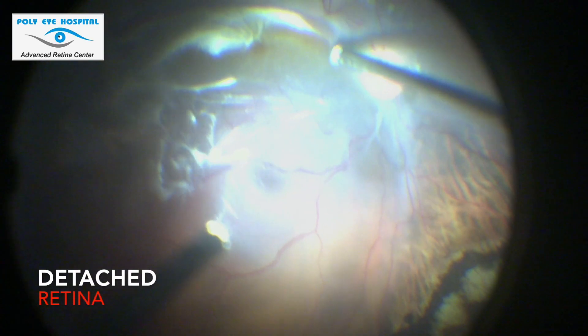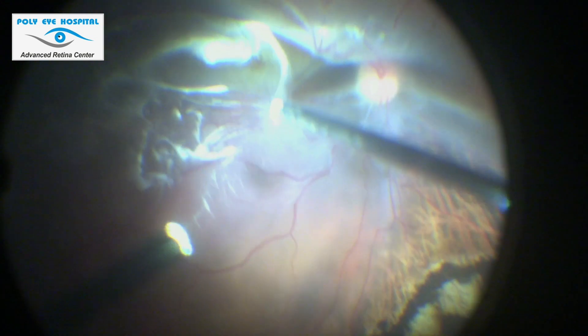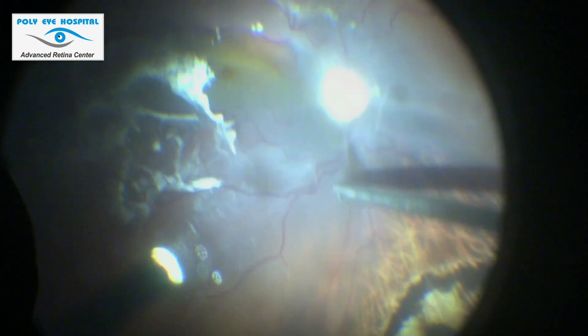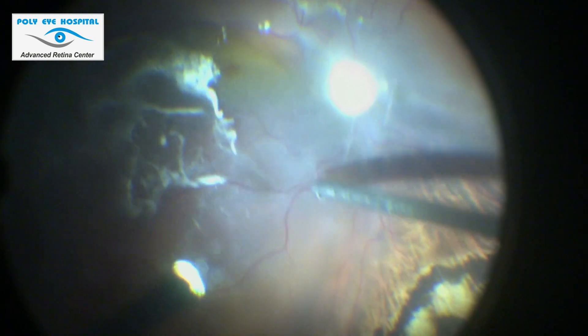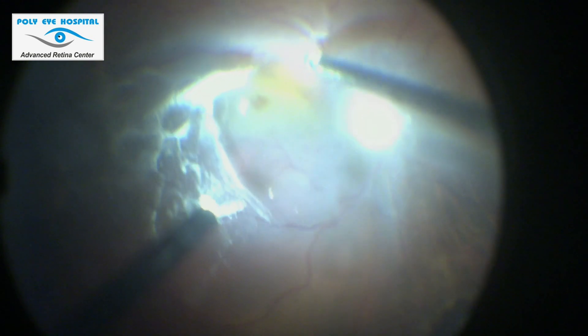Then the final pull is given in the anterior-posterior direction to complete PVD. The next case is when the retina is detached. The technique remains the same, but we need to keep in mind preventing iatrogenic breaks. For that, vacuum should be increased slowly to block the mouth of the cutter with vitreous first, and once that happens, apply full vacuum to pull the vitreous tangentially. This will prevent retinal bites and allow safe completion of the PVD.